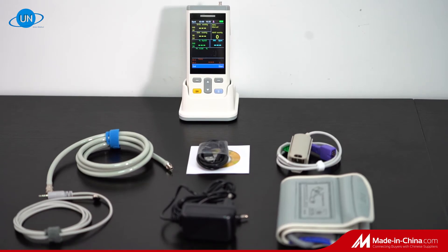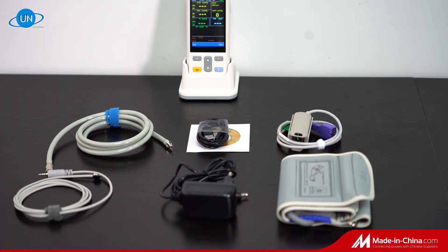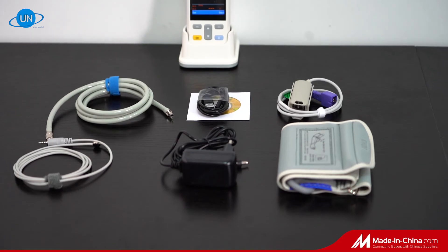With a USB port, testing data can be transferred to a PC. We are continually improving and welcome your comments.